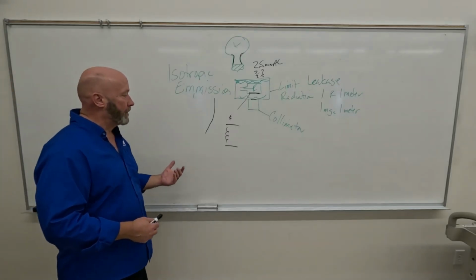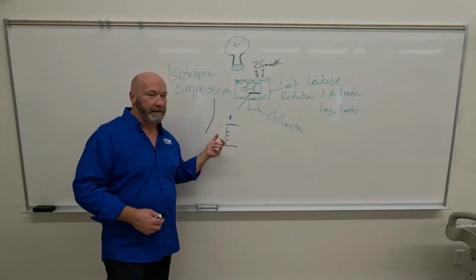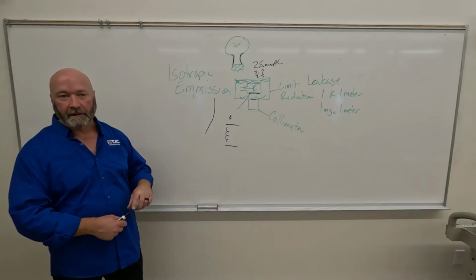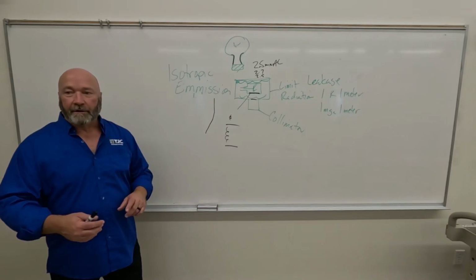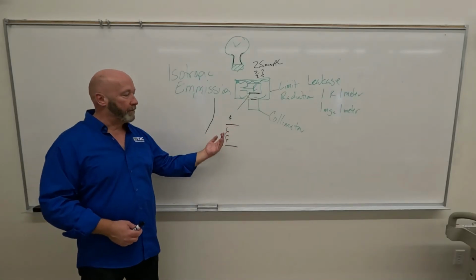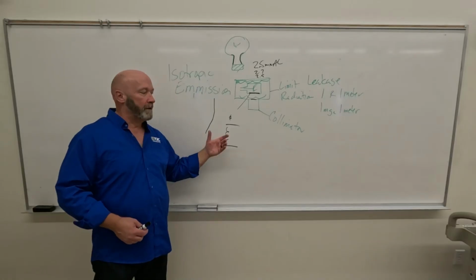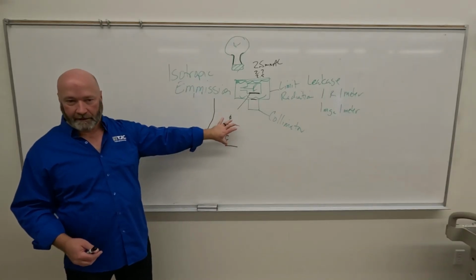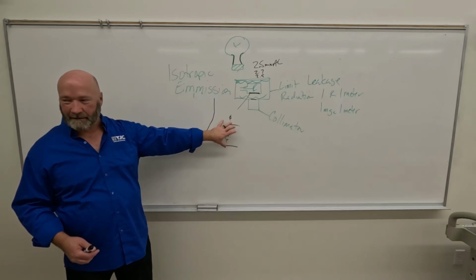We get to a point where we can't repopulate the filament quickly enough. Then saturation current is that once we make our exposure and send the electrons across the tube, we've made room for more electrons. Does that make sense?